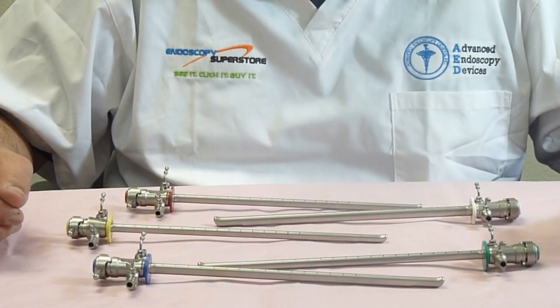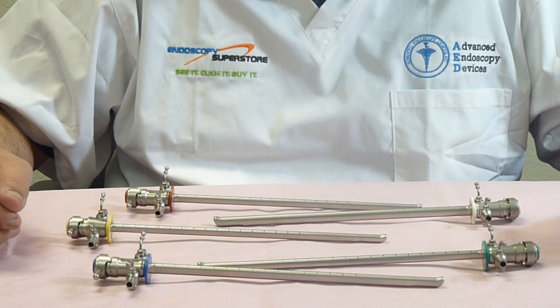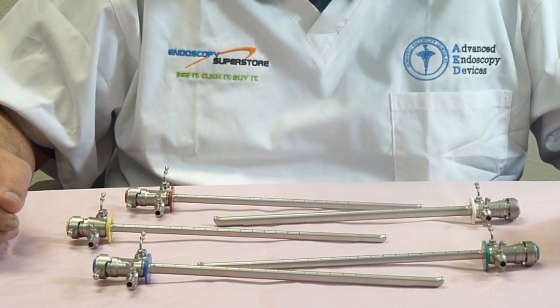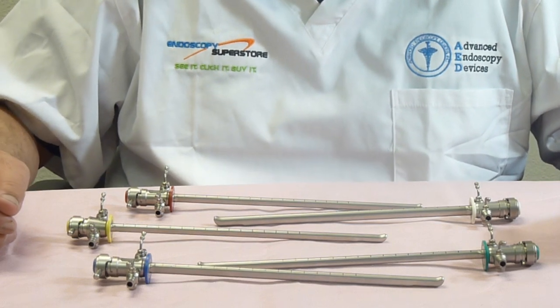Welcome to Endoscopy Superstore. Today I'd like to introduce you to our rigid cystoscopy line of instruments. We have sheaths available, we have bridges available, we have scopes available, optical forceps, and flexible forceps.